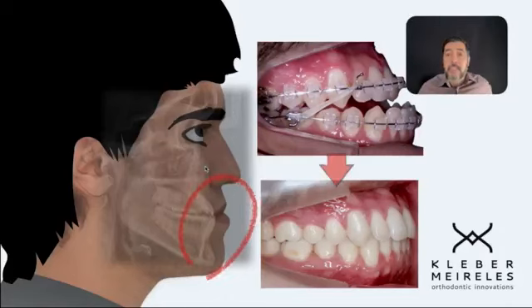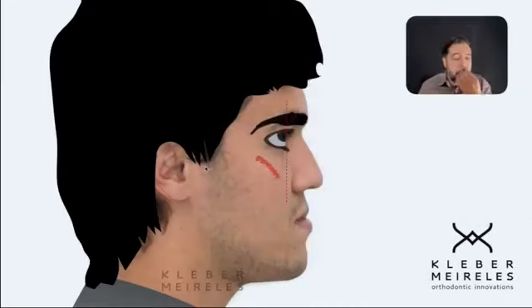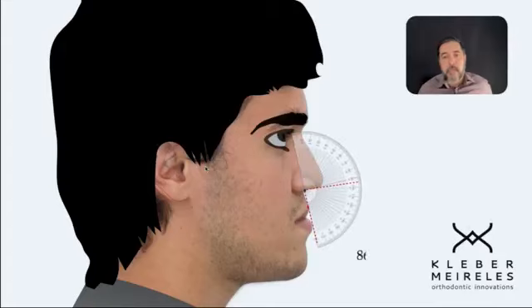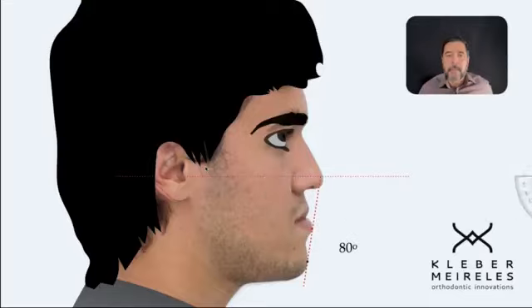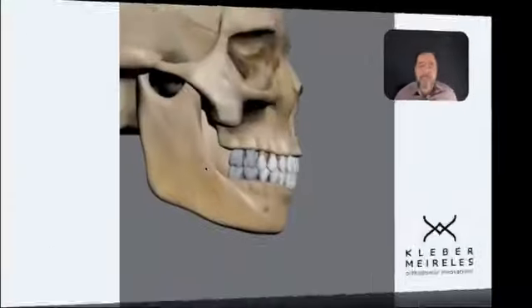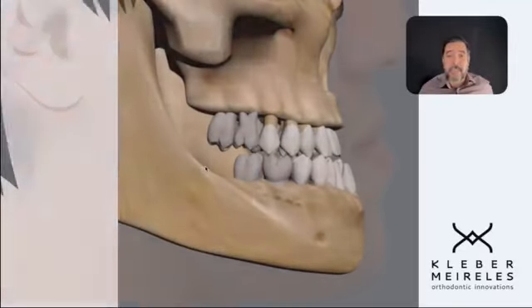just using standard straight wire brackets, and since they want class 2 in this case, because I'm preparing for orthognathic surgery, and our facial analysis showed us the importance of decompensating for orthognathic surgery. I'm just showing the example, I'm not focusing here on the theory behind that, because this is not an orthognathic surgery class, okay?